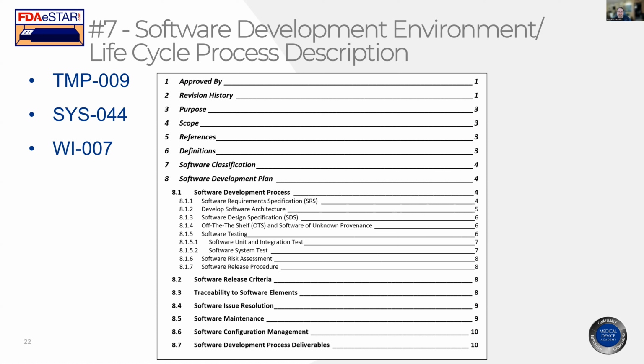So you'd attach all 3 documents. You might even attach some other documents that you might have developed as well. Maybe work instruction 8, which we're going to be releasing in a couple weeks here, maybe even next week, for when you find vulnerabilities, what do you do? So it's incident reporting policy.